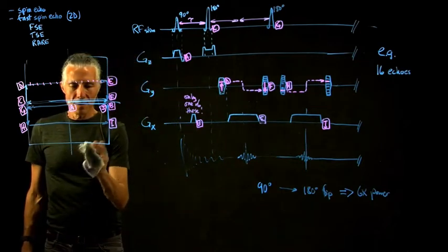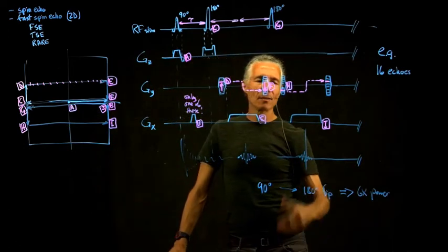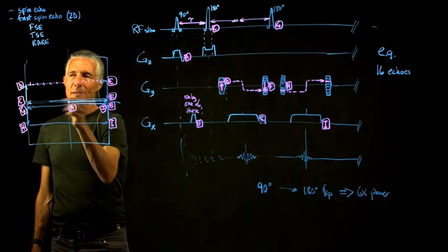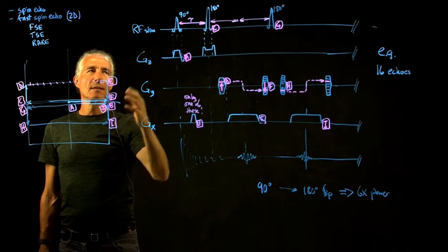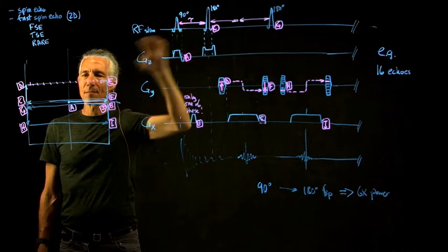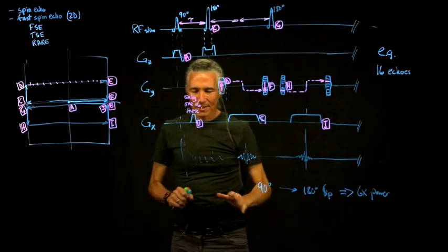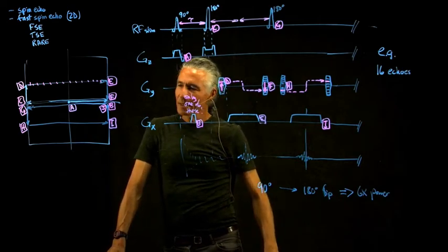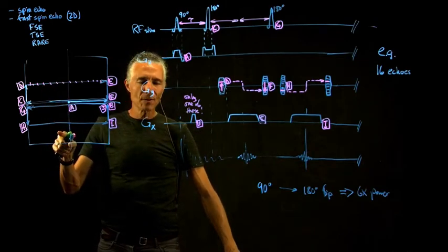But there's another interesting thing, which is what kind of contrast do you get out of this? I described this typically as a way to get good T2 contrast. So now we're getting 16 lines of k-space for every 90-degree RF pulse. Then we have to wait 3 or 4 seconds for the longitudinal magnetization to recover before we can do that slice again. But we got 16 lines of k-space. When you think about this, you can see this is something that happens with all sorts of more advanced pulse sequences. We're ending up in a strange world where we collected different parts of k-space with different amounts of T2 decay.